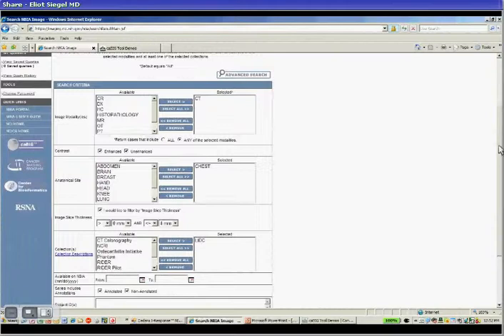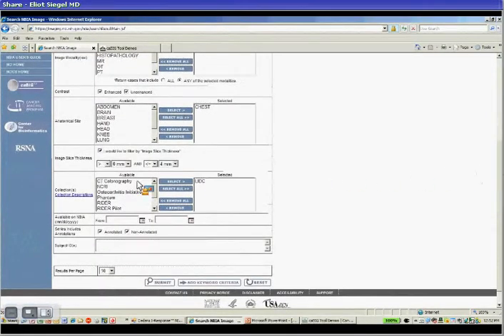So for the purposes of this search, I'd like to pick images that have relatively thin sections, and so I'm going to pick CT studies that have slice thickness of less than 4 millimeters, which means anywhere from less than 1 millimeter up to 3 millimeters. And then we have a number of different collections, including CT colonography, a collection called NCRI, which represents pathology images associated with a project on colon cancer MRI studies that we have with a group in the United Kingdom.